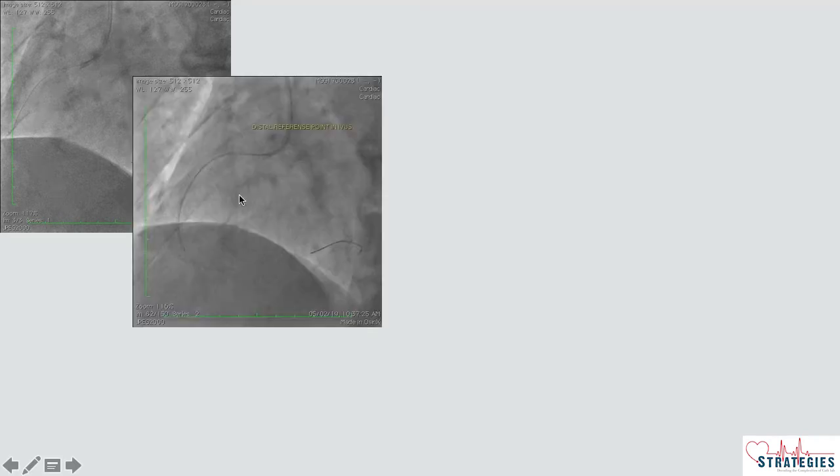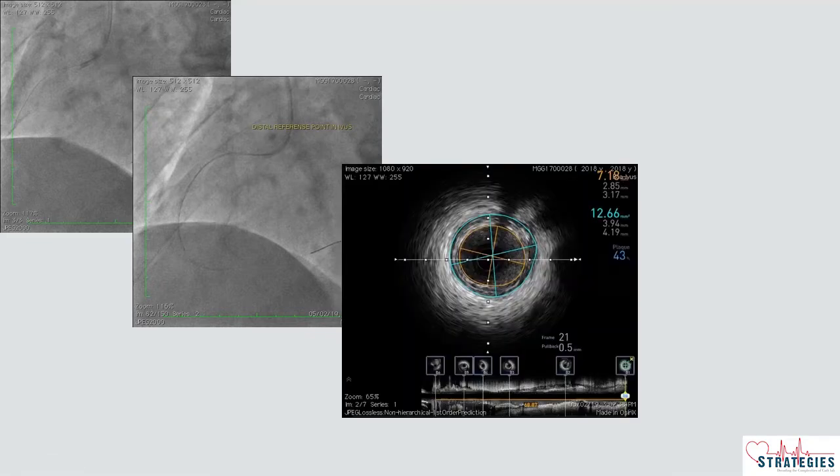So we cannulated the RCA, wide RCA. Then I did IVUS. This is the first IVUS through the RCA, with which we can identify the distal reference area, which you can see in fluoroscopy. This is a point. So this is my distal landing point.